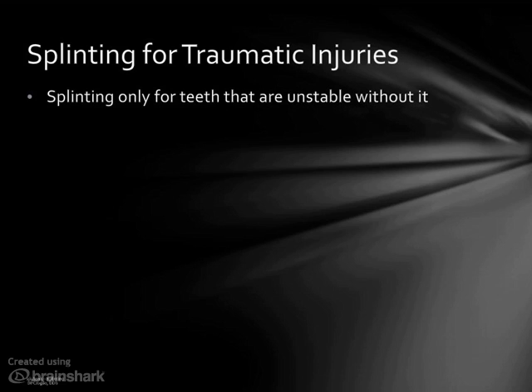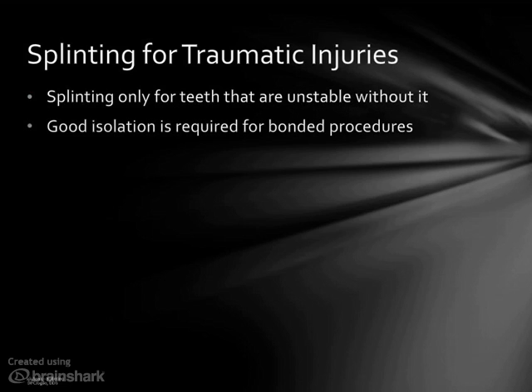Since we are using adhesive dentistry techniques, having a well-isolated dry field is a must. Splints are generally left in place for 7 days, unless there is significant mobility. Also, if patient discomfort warrants it, the splint can be left for longer periods.